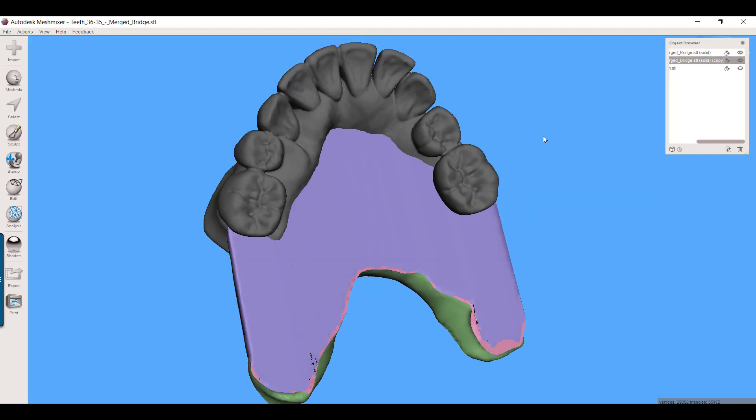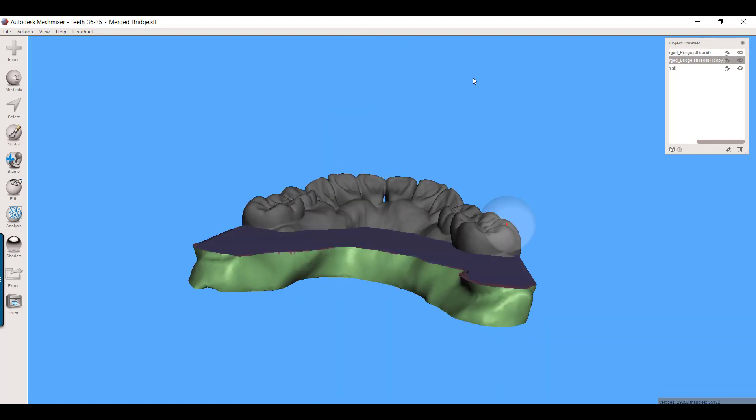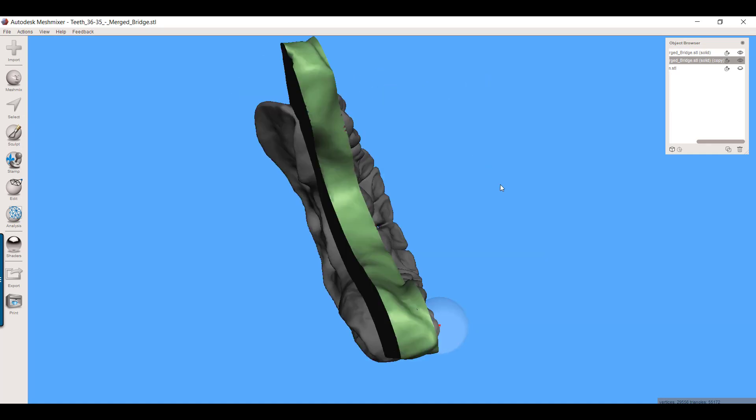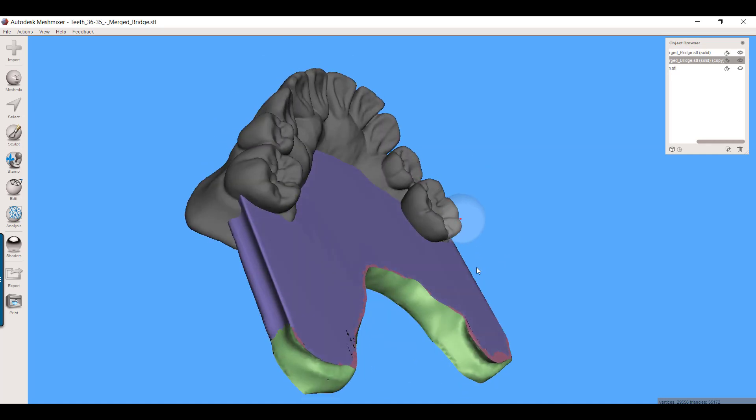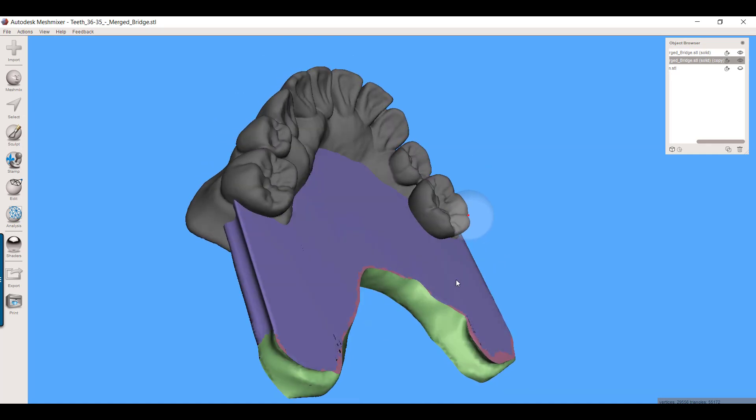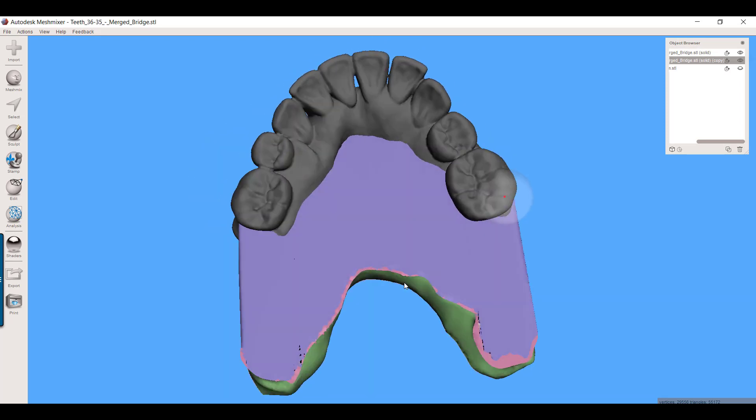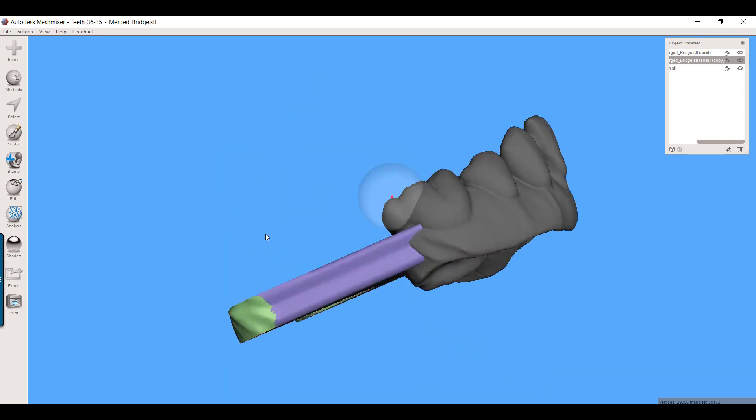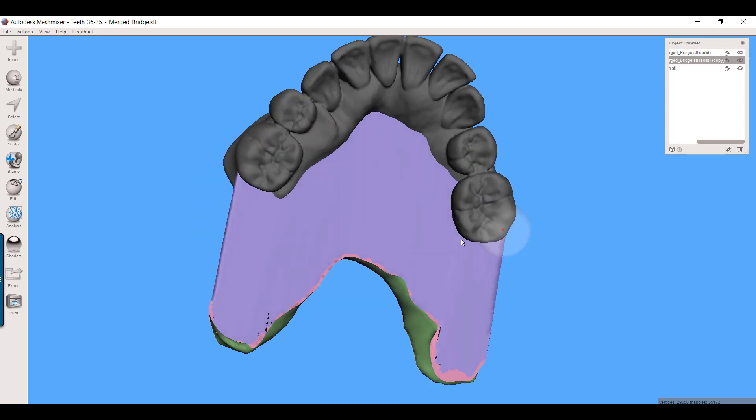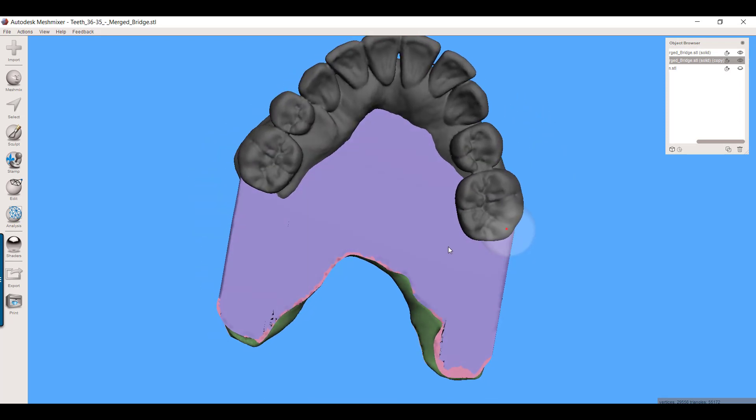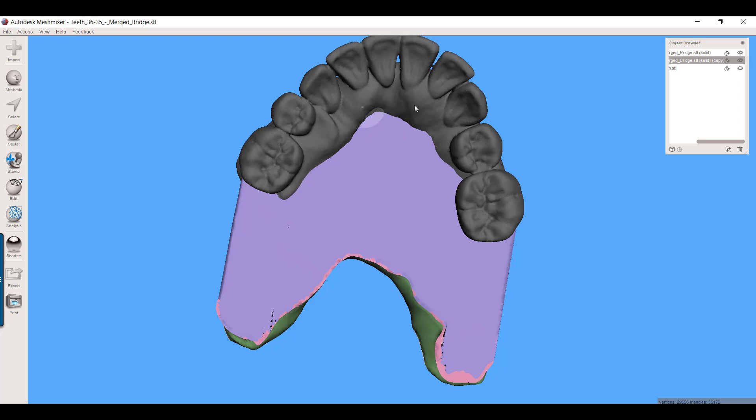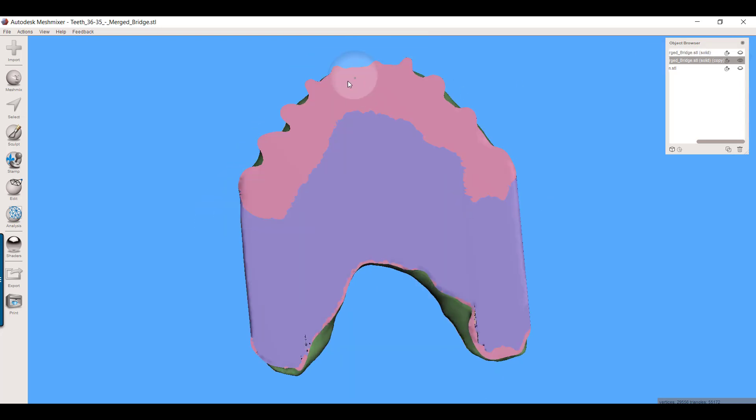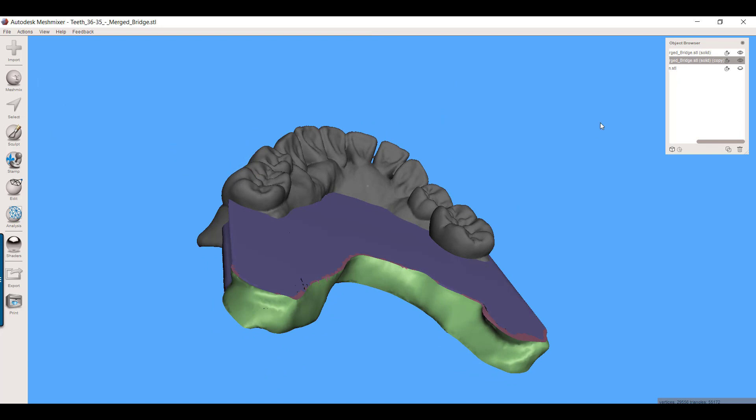Now I want you to look at what we've created. We've created a template that we can use to lay over our Trilor and trim that front edge to this exact shape. The back edge is going to be easy because we just bond it into this temp and then we just cut away all the excess that sticks out. This front edge is what we're concerned most about right up in here. How do we trim the Trilor bar to that exact shape?